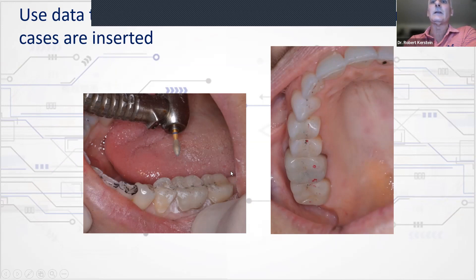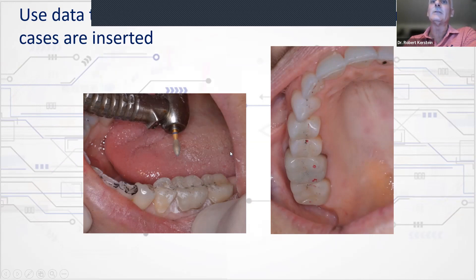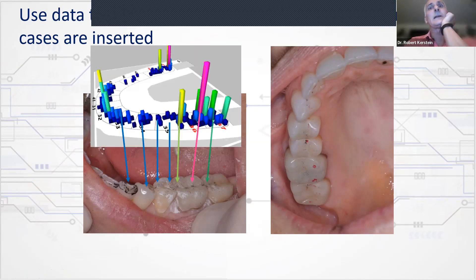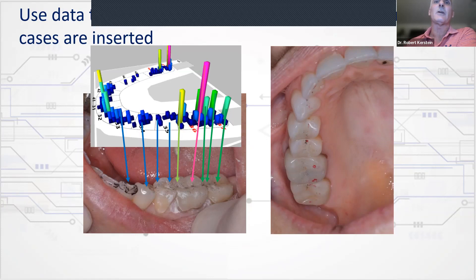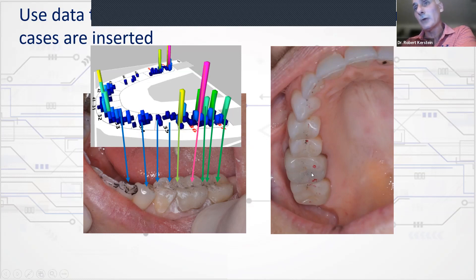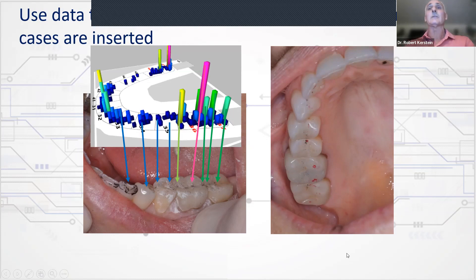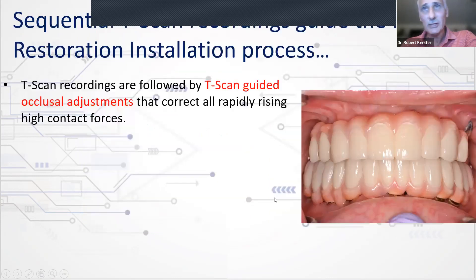When you're delivering and adjusting restorations with dots on teeth, rather than assuming same-sized dots mean good contacts, use data to choose marks intelligently. You may shape contacts any way you believe is correct, but identical shape or size doesn't guarantee low force, uniformity, or simultaneity — none of that can be seen in the ink. It's better to use the data to understand the ink, and that's what I'm going to show you.